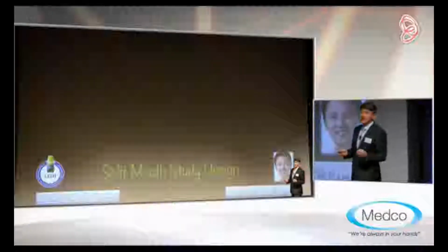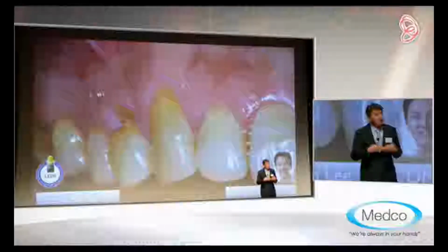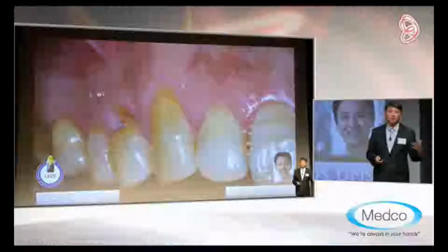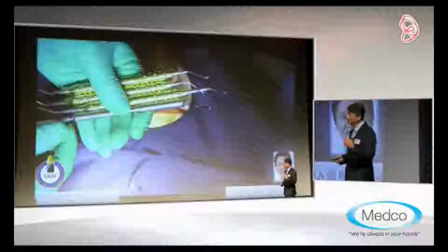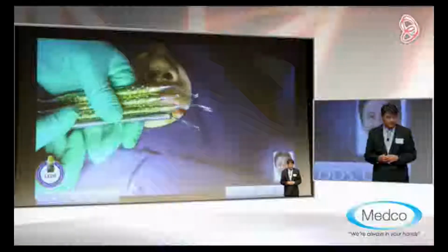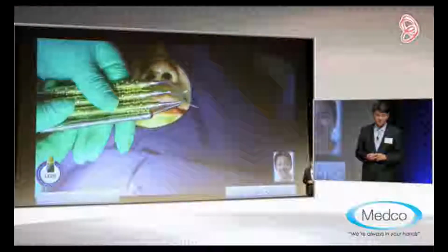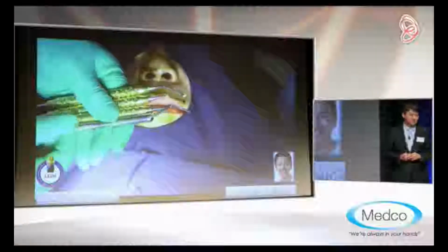And in our clinic, when we run courses, we like to do split mouth study. So as we know that we can grow bone utilizing this tunneling technique, we can also grow gingiva coronally to reduce sensitivity to our patient. So these are the latest instruments I developed. I named this technique MIT technique. It's not Massachusetts Institute of Technology. It stands for minimally invasive tunneling technique.